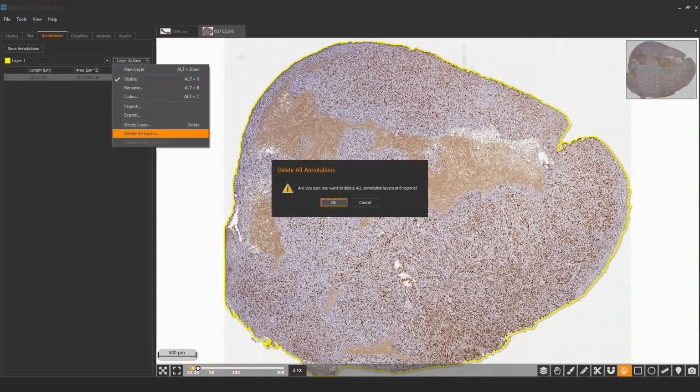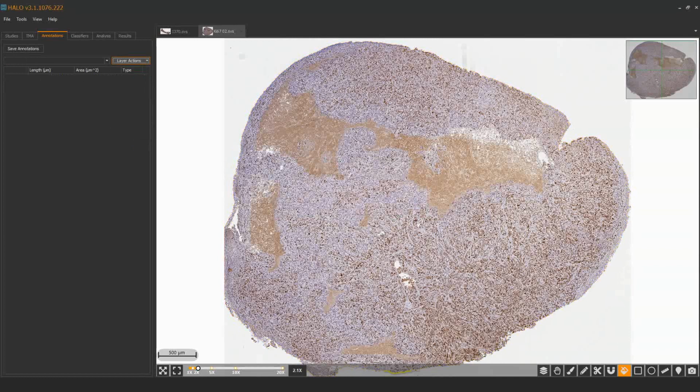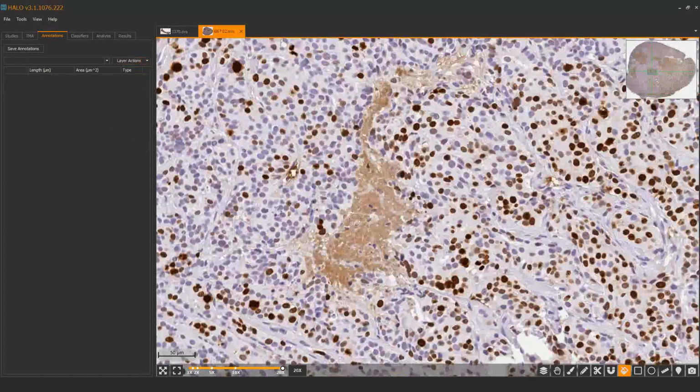It also can be used at higher magnification. So if I wanted to zoom right in and maybe make the tool a little bit smaller, you'll see how it just grabs this necrotic region. So it's not just for whole tissue. You can actually pick out tissue subtypes using it. And more specific than that, you can actually make the tool pick out very small features. So there's just a stained nuclei that it's selecting.